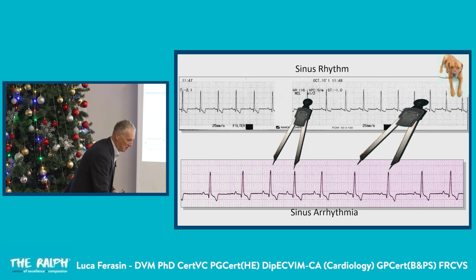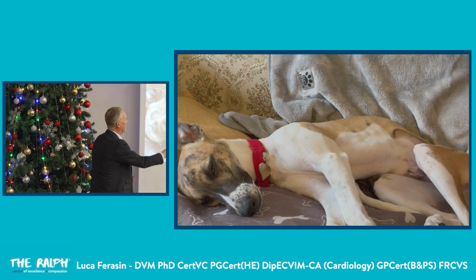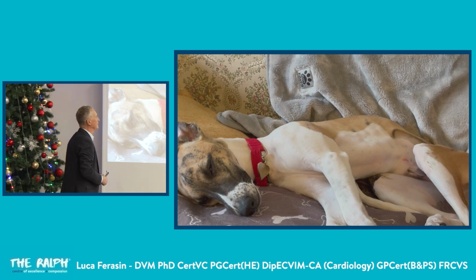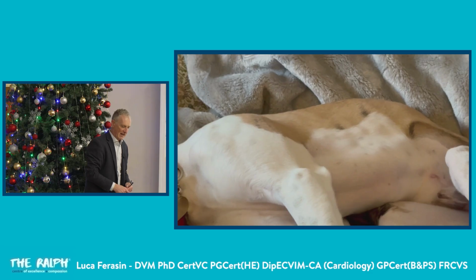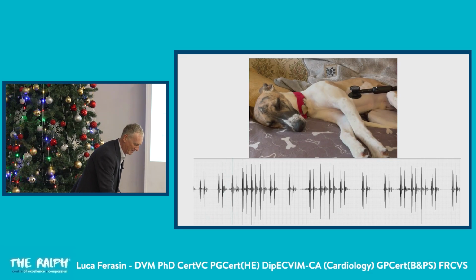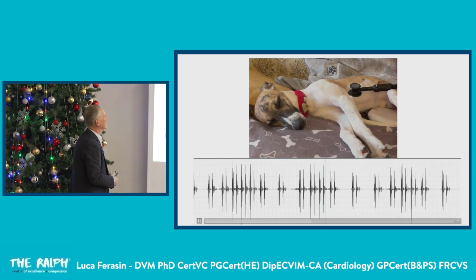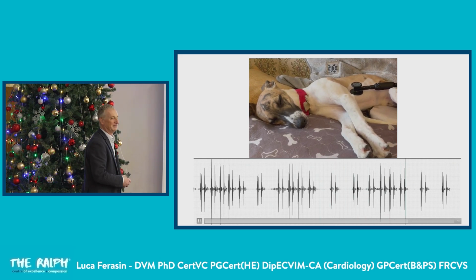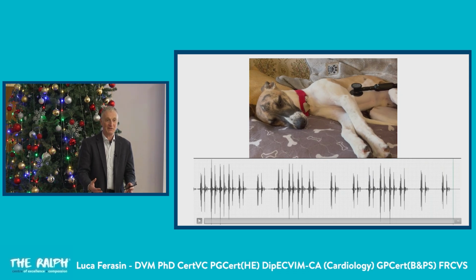So that's our new puppy. And one day we were watching it, I said, oh wow, look at that. Look at the heartbeat that changes during respiration. When it breathes in, it increases. Look at that. Isn't it beautiful? And we did more than that. We recorded a phonocardiogram. That's a beautiful example of respiratory sinus arrhythmia.